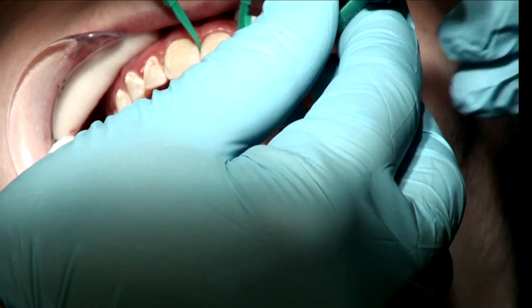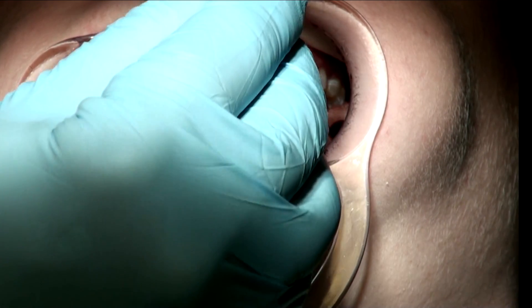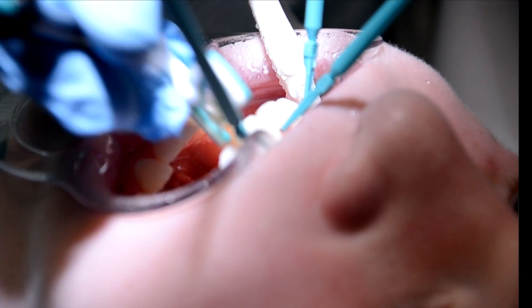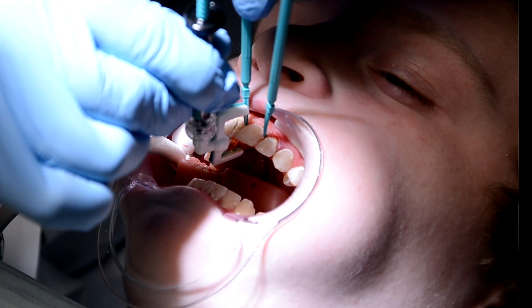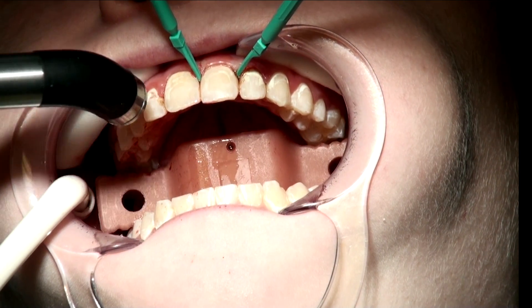The Icon is a yellowish liquid that's somewhat viscous. It does not have any fillers in it, so it does not appear radio-opaque. The Icon applicator makes it easy to floss in between the teeth and deliver the material right where you need it. Light cure for 40 seconds.